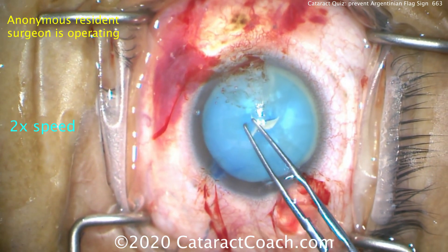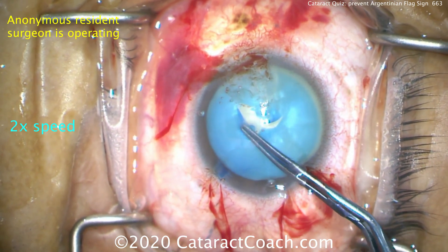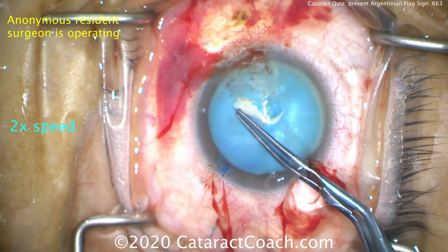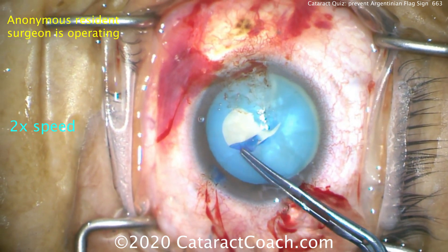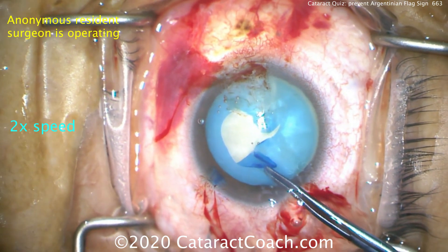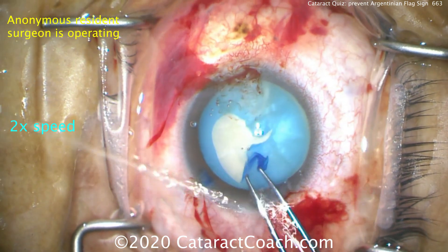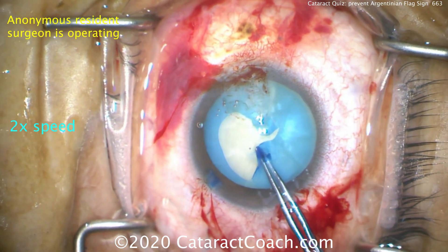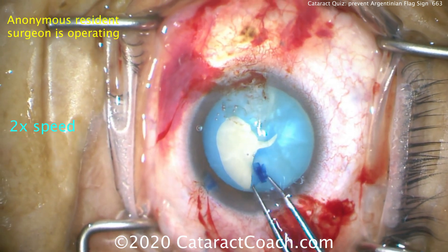Having a tough time grabbing the capsule — grabbing something. There it is, grabbing the capsule and bringing it around. Good grip, reasonable control. But look at the incision — we're losing viscoelastic out of the incision, so the AC is shallowing. Look at all the viscoelastic coming out. Now it's going to run out. The resident's going to try to pull on it and — oh boy — it looks like it's already run out.